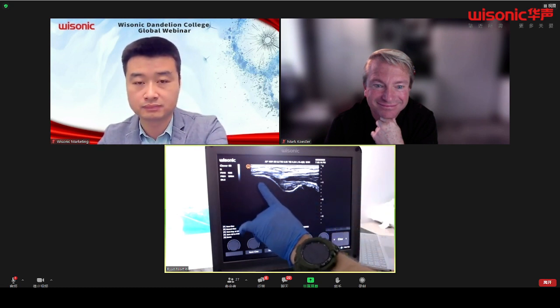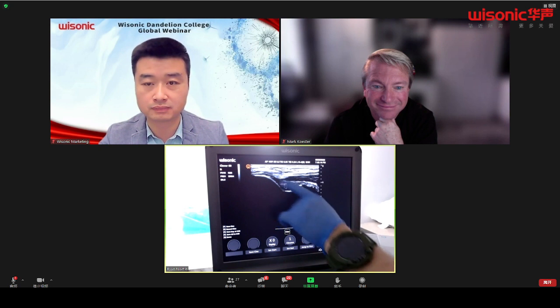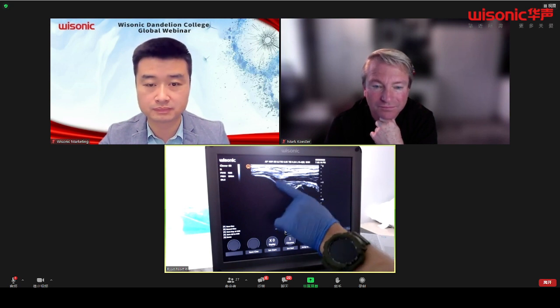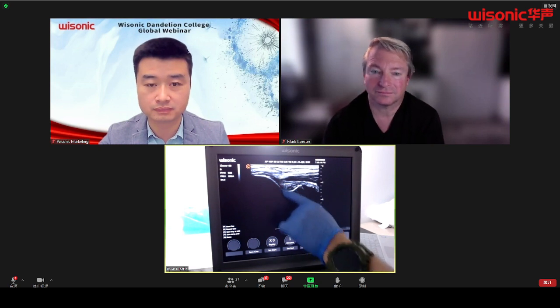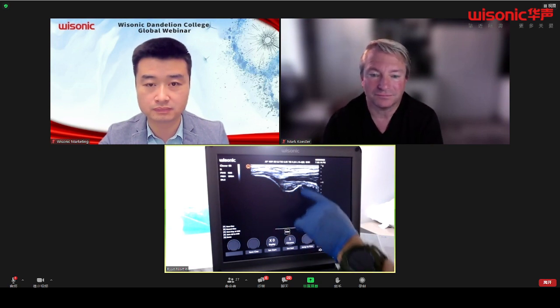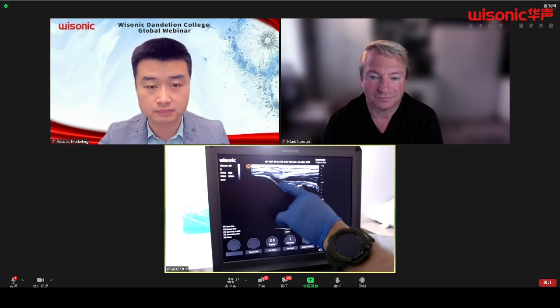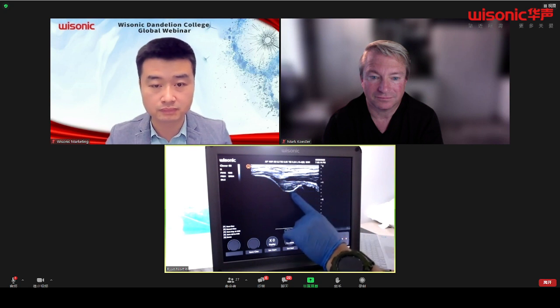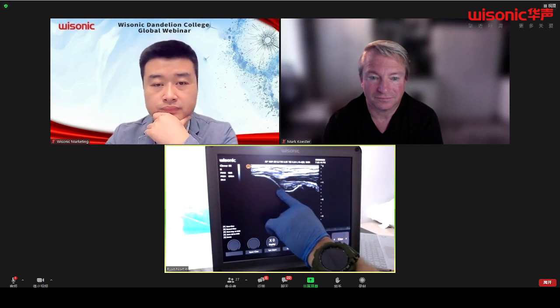So here's the medial epicondyle. Here's that slope as it comes down, right? And so along this ridge here is that triangular shape of the UCL. The UCL comes up and over, remember, off that trochlear spoon, remember that ladle we talked about. Here's the joint line right here, and here's that sublime tubercle off of the ulna right here. I'll clean that picture up here a little bit. But one thing I note is this space right in here looks a little disrupted to me.